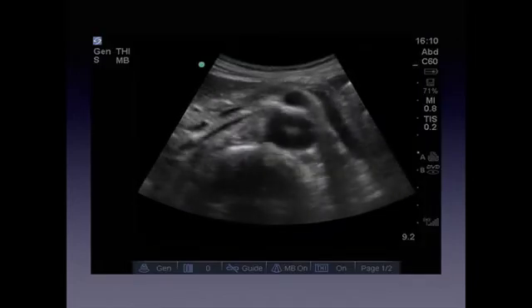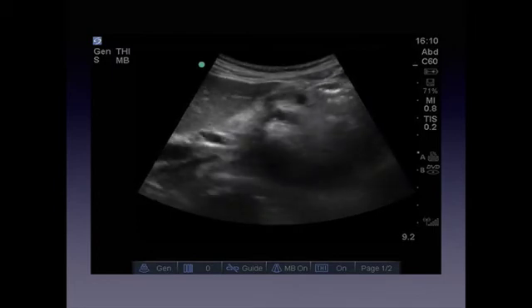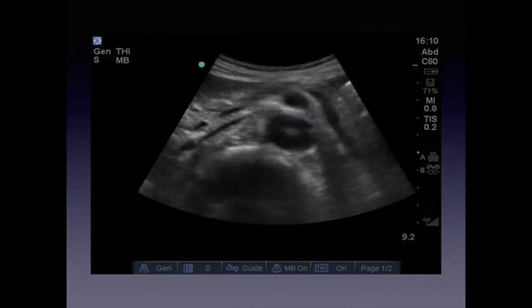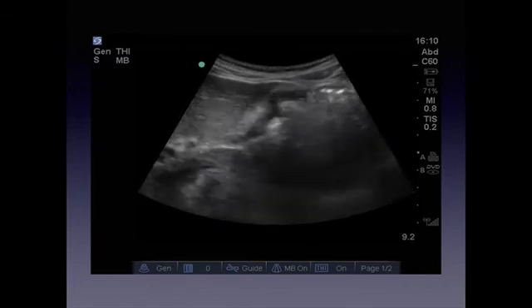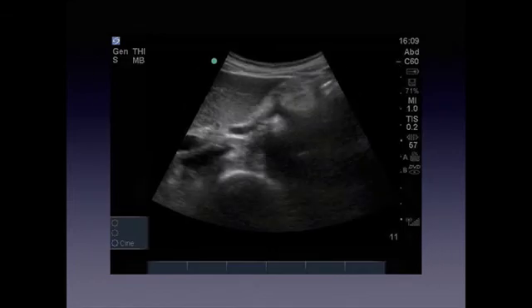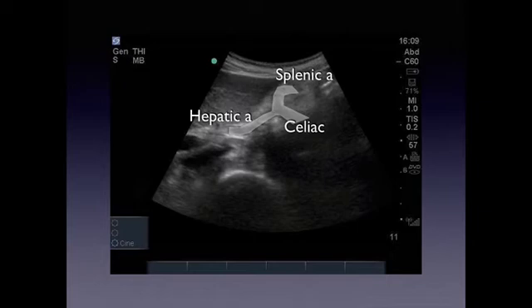This is just an example of a more real life, not pretty celiac trunk. And as you can see right by the liver to the left right there, it's kind of leaning over to the side. So here would be the example of that. So celiac, and you can see the spine below with the bright white, and then the aorta, all the walls are not visible in the aorta, but you can see where it starts there, right above the spine.